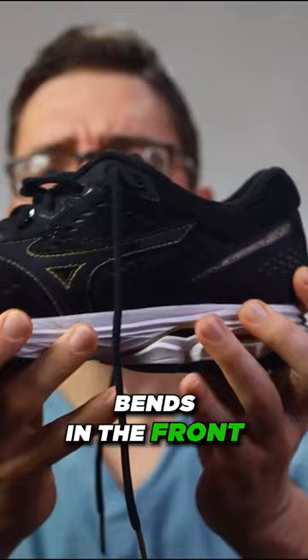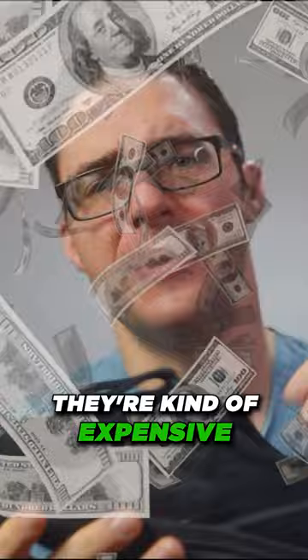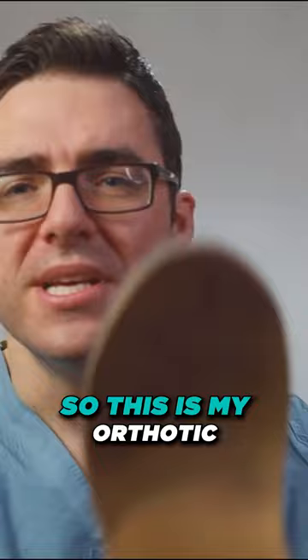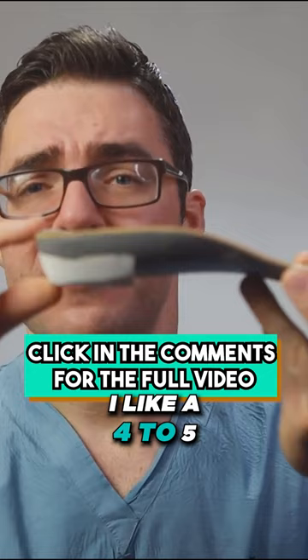I have a pair of Brooks right here — I love them, they're kind of expensive. Take a look at my insert: I have a higher arch myself, so this is my orthotic. You can see just how built up it is — you need a huge arch. And look at how much of a heel that is. I like a four to five millimeter heel depending on the patient; this makes a monster difference.